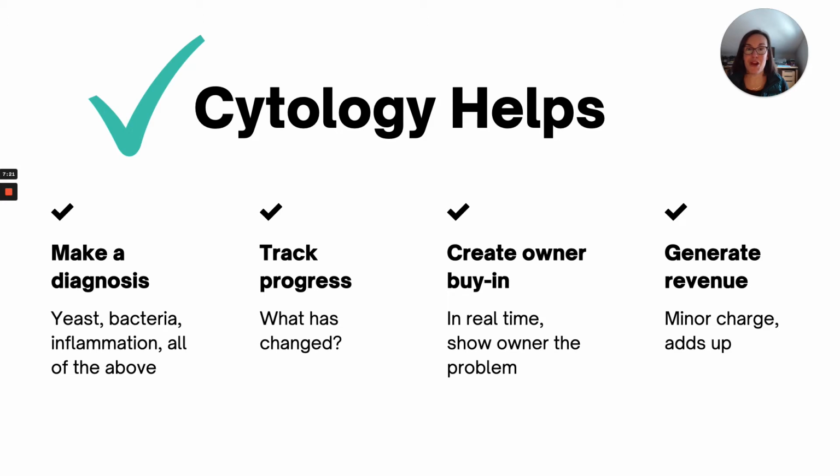At the minimum, you're not going to want to stop treatment for your pyoderma unless it's something that's just not working, and you're going to then have a non-empirical selection of antibiotics because you say, oh, we're going to have to culture because you're not getting better. But definitely tracking progress with cytology really helps you to say, yes, this is better, or no, this is not better, versus just looking at the patient and then deciding. So I do think that having that as part of our track progress tool, especially for ear infections, really helps.